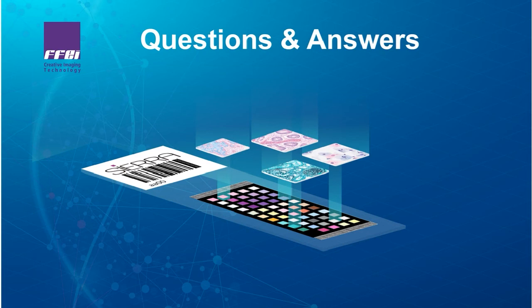The effect is quite obvious on the different colours between with and without applying this profile on actual tissue samples. One example may be if the definition of colour isn't accurate between areas of similarly coloured interest. So, for example, in the nuclei of a cell, it may be difficult for a pathologist to visually resolve some of the internuclear detail, for example, if all the purples of the hematoxylin blend in together poorly. So this technology allows very precise pixel by pixel definition of colours for that purpose.